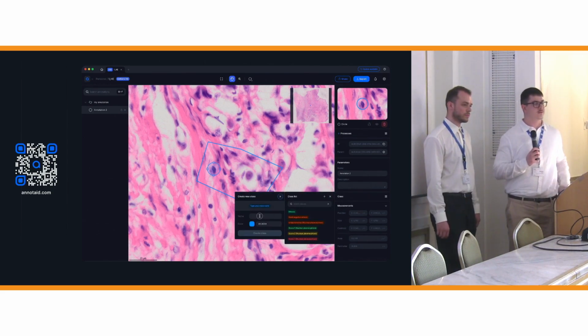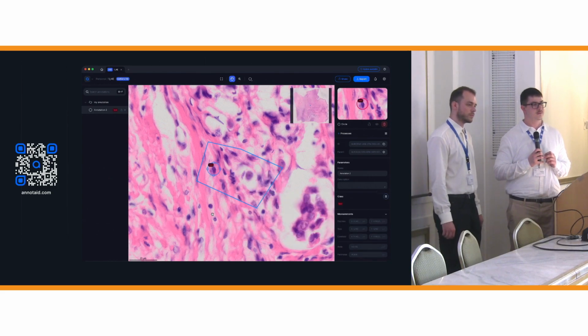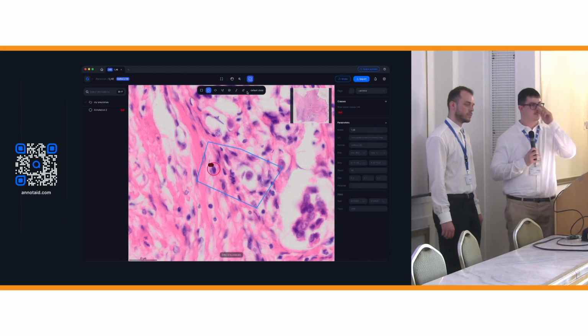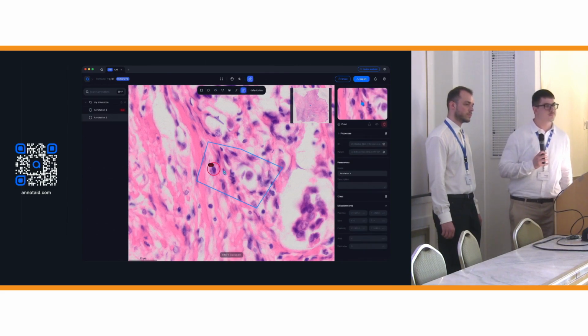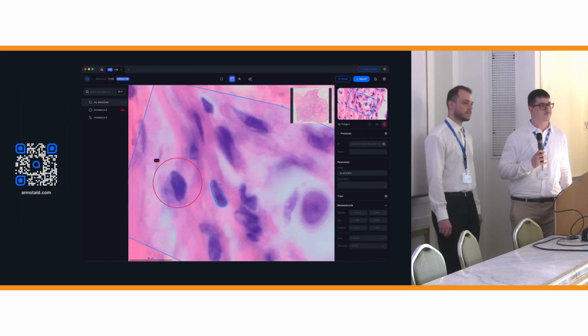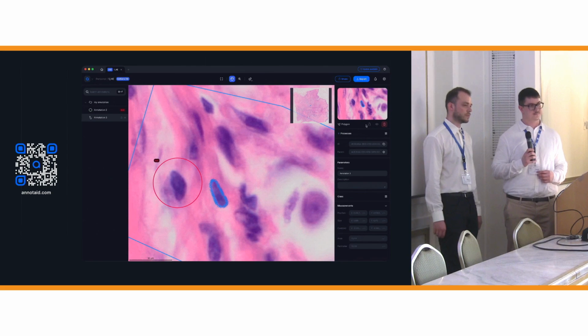I have a question about changing the annotations. In one of the visualizations, it showed that the user can just reject or accept the annotation. So what about when the bounding box, for instance, is incorrect? Is there an option to move the bounding box, or do you assume that it is sufficiently good that it doesn't need to be retrained? Or are you interested in just training the classification model?